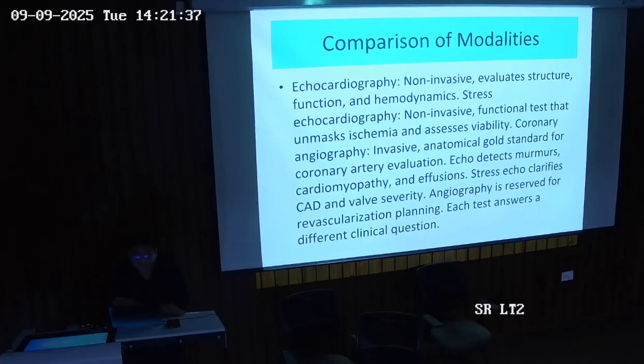Coronary angiography has a negative point because it is an invasive procedure, but it is anatomically the gold standard for coronary artery evaluation. Echo detects murmur, cardiomyopathy, effusion, along with ischemia. Stress echo clarifies the CAD and valve severity. It is the better choice for clarifying severity of valve disease, because the hemodynamics and pressure gradient can be detected by the stress echo. Angiography is reserved for revascularization planning.